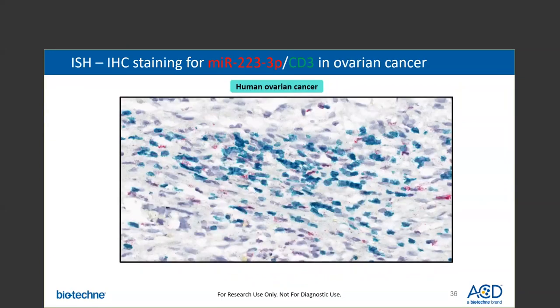Here is another example of sequential ISH-IHC staining performed on human ovarian cancer tissue, again showing the detection of myeloid-specific microRNA-223 and the T-cell marker CD3 on the same tissue section, demonstrating mutually exclusive localization of the two targets.